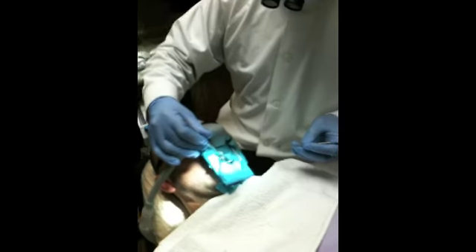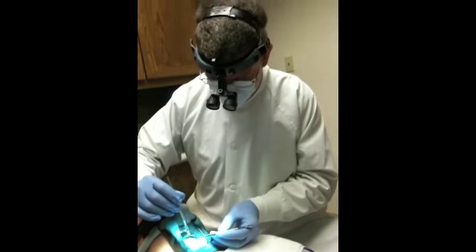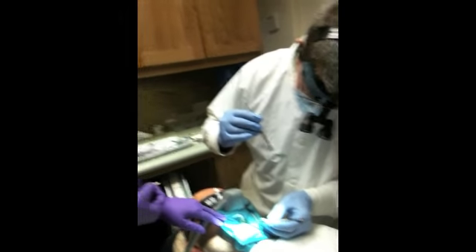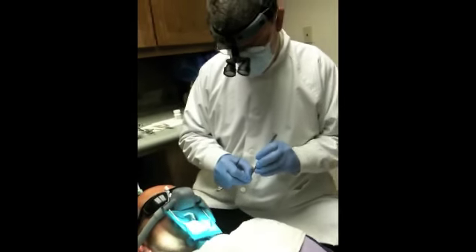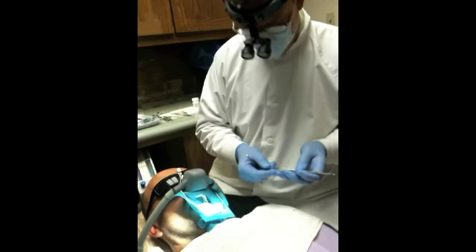It's not over yet — we're preparing to place what's called a matrix, which helps hold the filling in place while it sets. Is the pain over or is that going to continue? That's a good question. Has it been hurting a lot? Now it's okay. Good — it should continue not hurting.